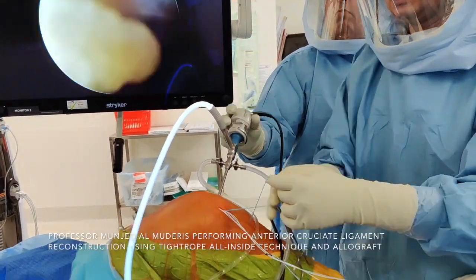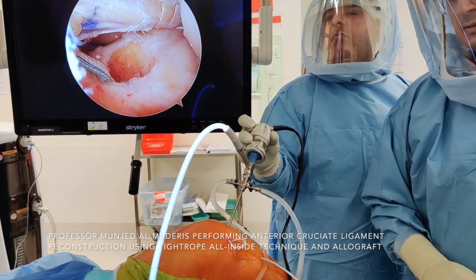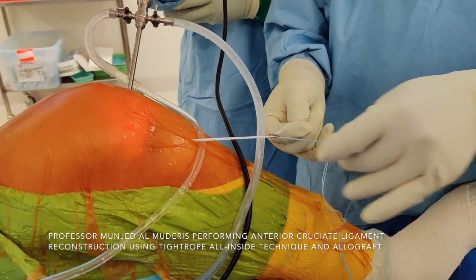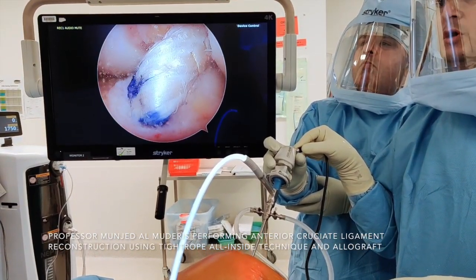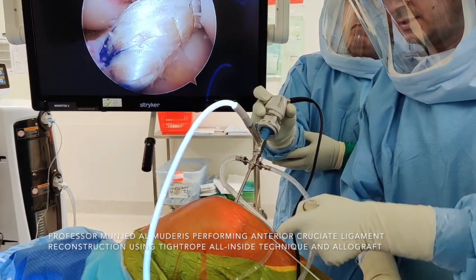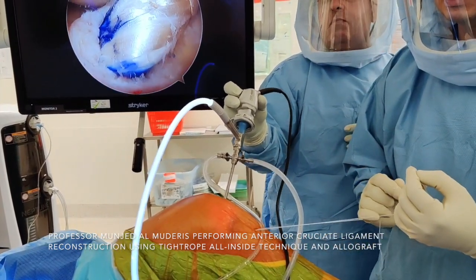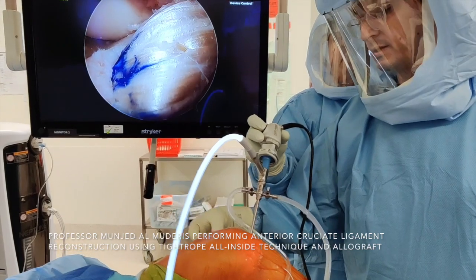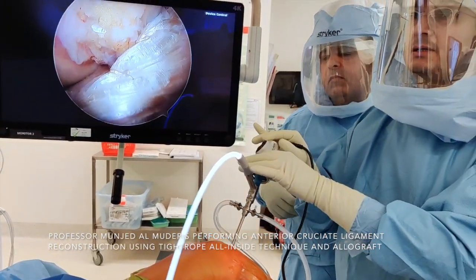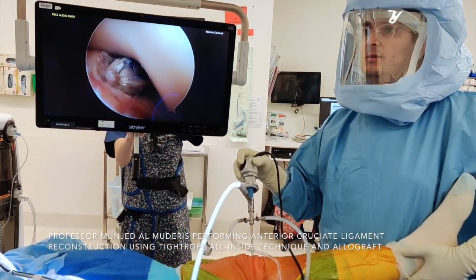Then we move on to the tibial side. I pass the sutures through the loop and deliver sutures through the tibial tunnel. I pull on the blue suture first, and you can see the button has come out and the graft is seated perfectly at the femoral tunnel. I tension the graft on the tibial side first, considering that I've positioned the femoral side already. I don't push the button down to the bone yet. I make sure that the graft is tensioned on the femoral side, then perform cyclic flexion-extension to make sure that the graft is not impinging on the knee.